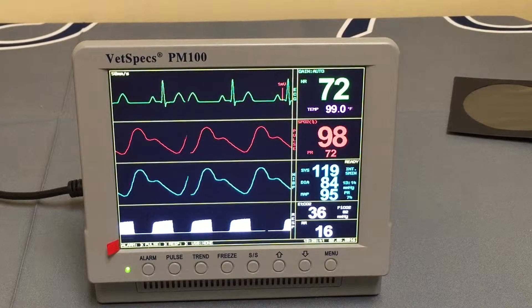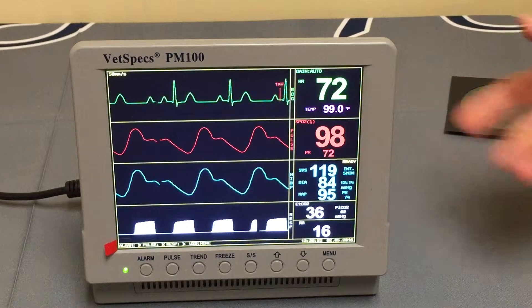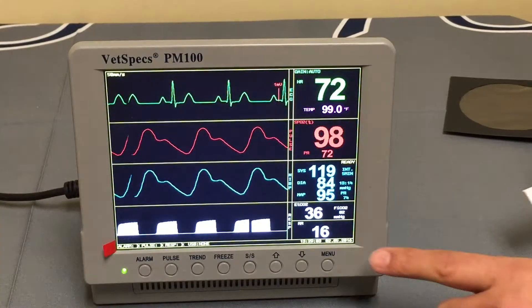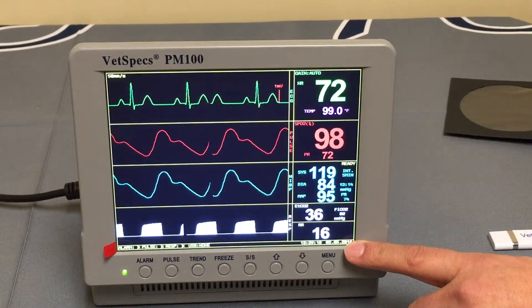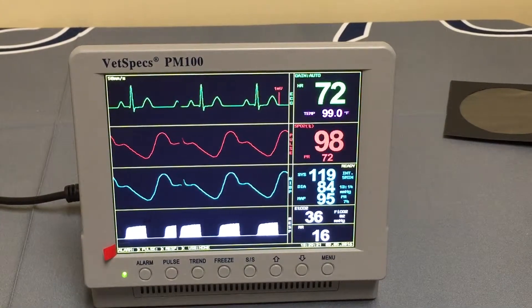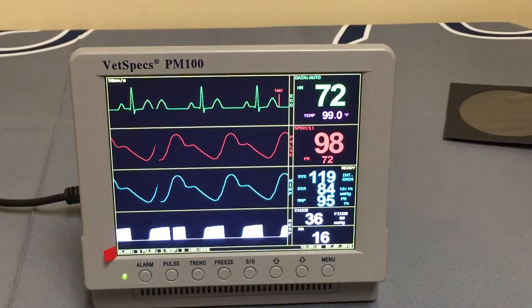VetSpecs has designed essentially a digital print right to the flash drive — what would historically have been a printout on paper is now printing data automatically to your flash drive. One important thing to note: make sure the date and time are correct. You may not be able to make it out in this video, but the lower right corner shows the date and time. Also, at the bottom of the screen, it will say USB None, indicating that a USB flash drive is not plugged in.